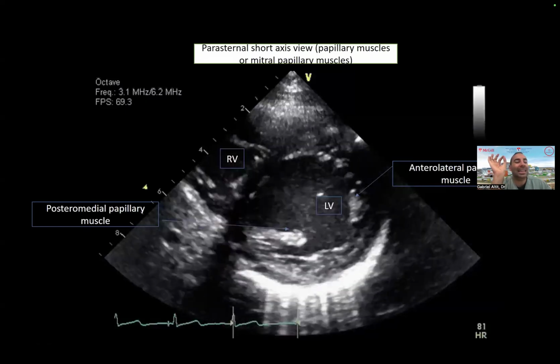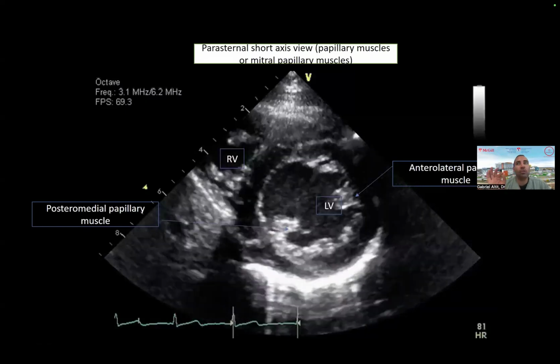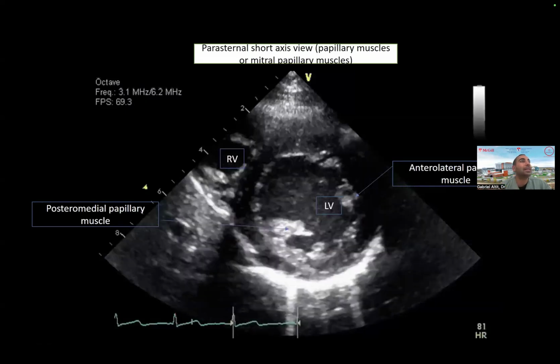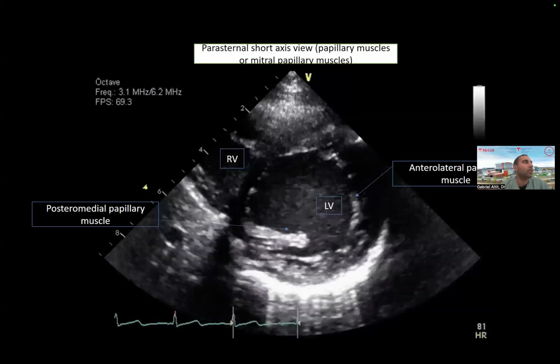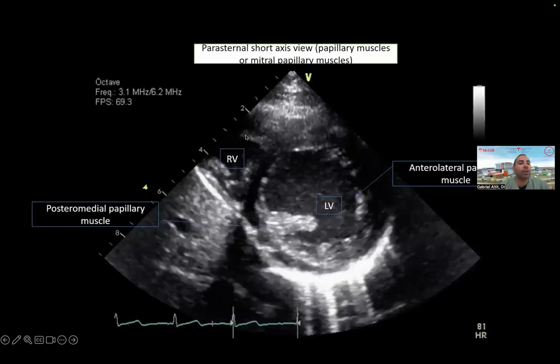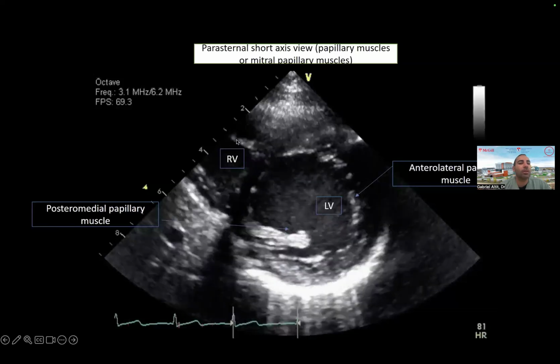Sometimes you'll see an LV tendon, which is actually fibrous tissue, which is like a little line that looks like a PICC line. It's not something that will get thicker because it's not muscle. It's just like a tendon. It's literally like fibrous tissue. Versus the moderator band, you see it actually on contraction, I don't know if you appreciate it, becomes thicker. You see it here.